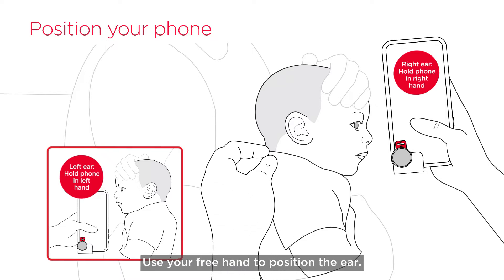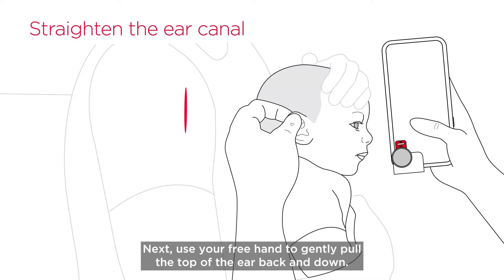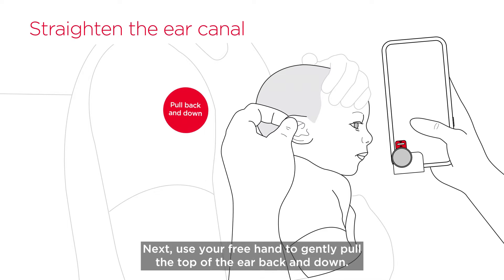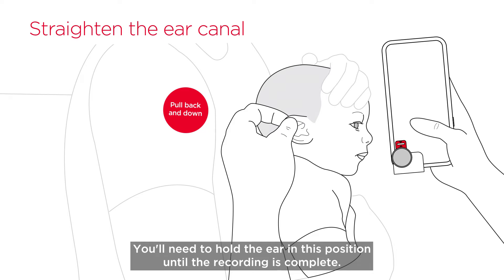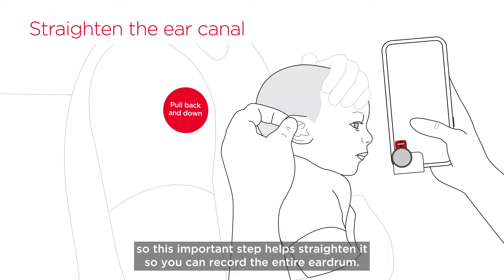Use your free hand to position the ear. Gently pull the top of the ear back and down. You'll need to hold the ear in this position until the recording is complete. Most ear canals are slightly curved, so this important step helps straighten it so you can record the entire eardrum.